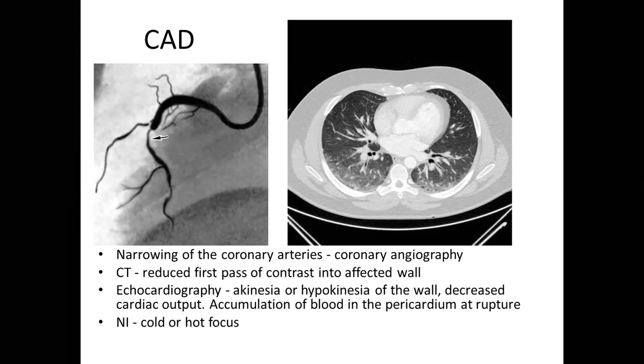And this patient has myocardial infarction, and you also see these ground glass opacities, bilateral, symmetrical, located in the posterior areas of the lungs, which means that the patient is developing respiratory failure because of pulmonary edema.